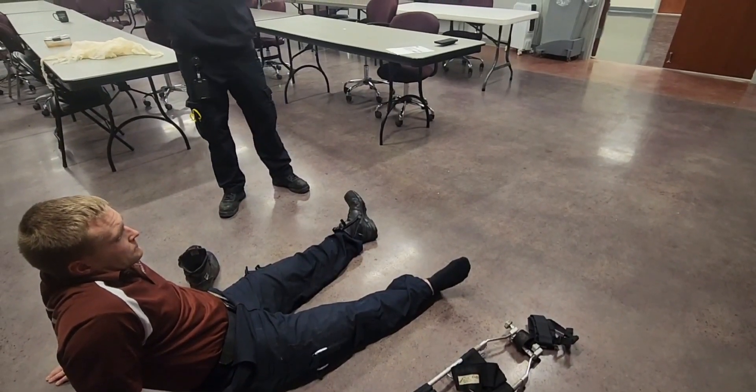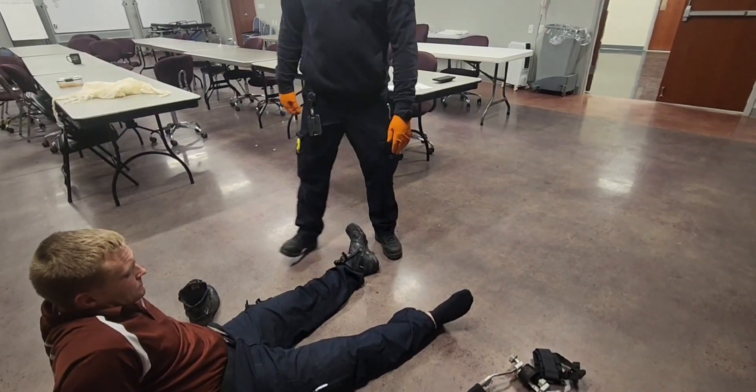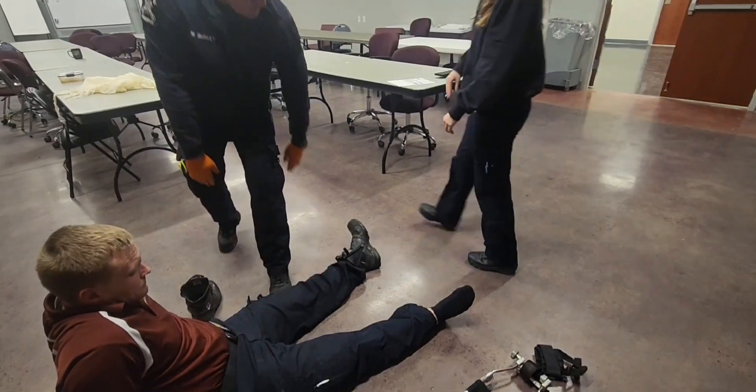I do not. I'll start by having my BSI on. I'm going to have my EMT assistant come and hold manual stabilization above and below the injury.